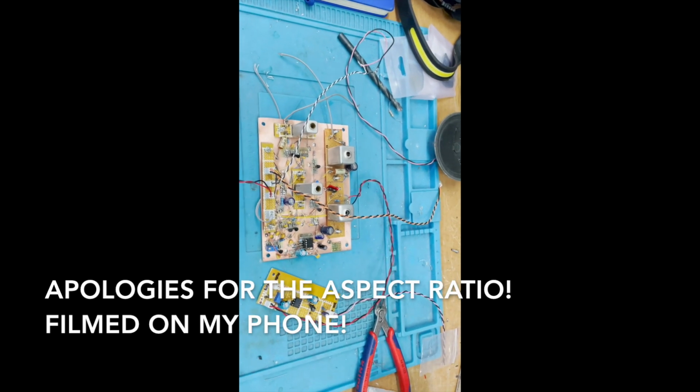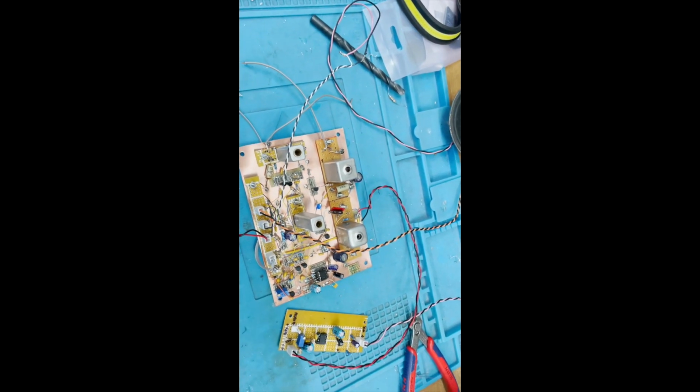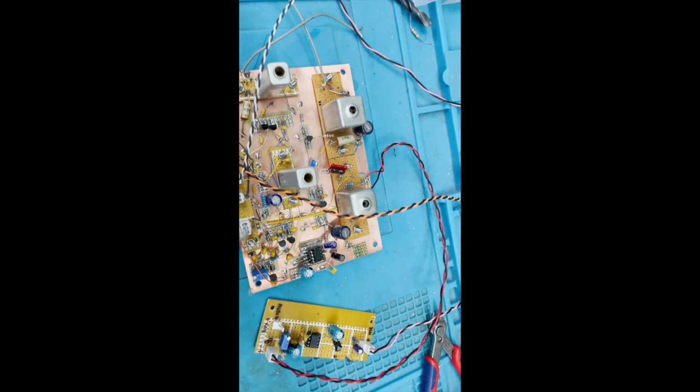One of the things that I noticed about building this Doppler machine is that it's quite important to make sure you've got a half decent ground plane. On my initial version, my prototype, call it what you like, which was made on some standard Vero strip board, what I noticed was that the LM386, which is down there, was quite sensitive and would quite frequently go into self-oscillation and become unstable.